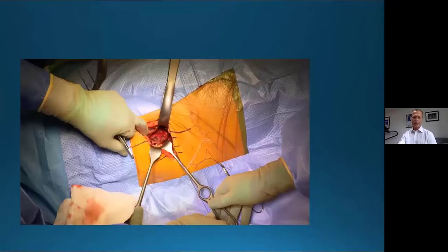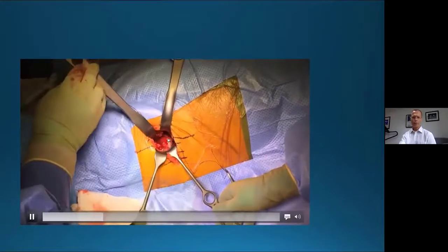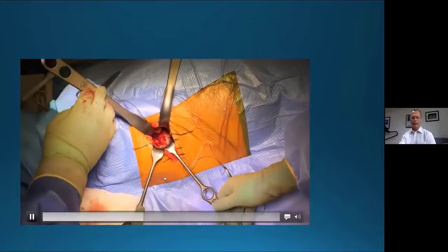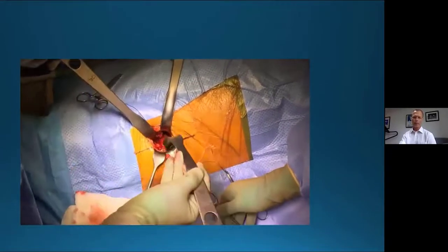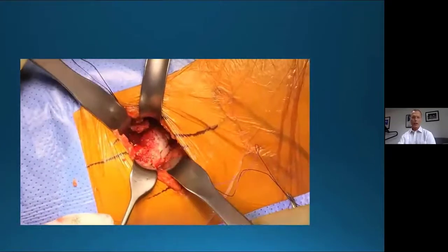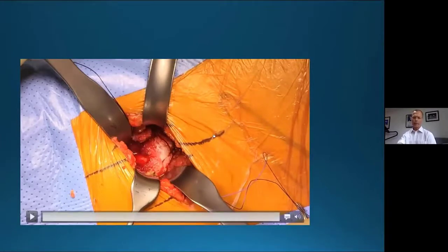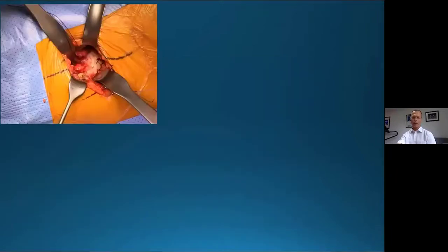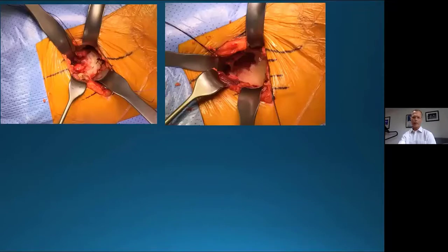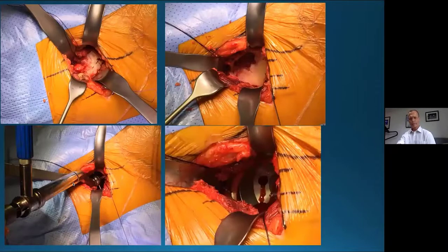And then we make capsular flaps. We tag a longer medial one, and then a shorter lateral one. And then the retractors go around the femoral neck, so it's still exposed. It takes a bit of getting used to dividing the femoral neck in this position. I just use the neck cutting guide and make an initial mark. In terms of the neck cut length, we key that off the distance from the lesser trochanter. Then we can use the foot retractors to see the acetabulum sufficiently, then the offset acetabular reamer, and then you can impact the acetabular component there. You can see the transverse acetabular ligament if you like to use that to assist with your alignment.